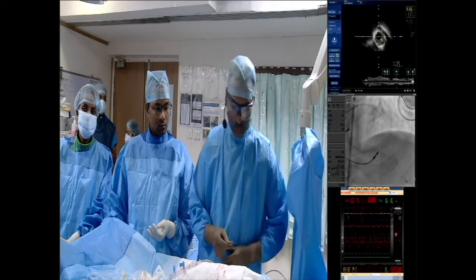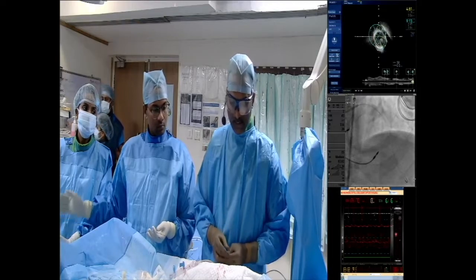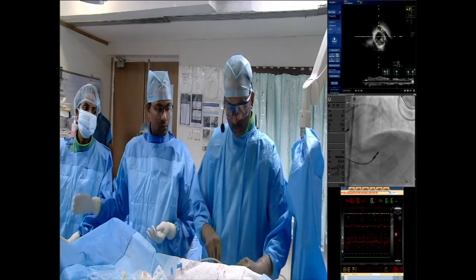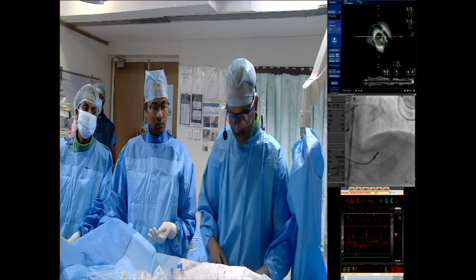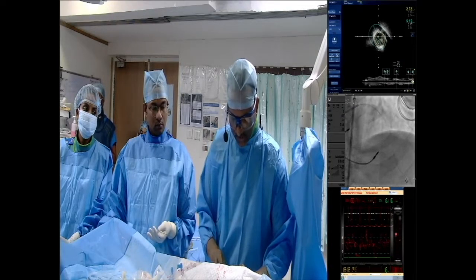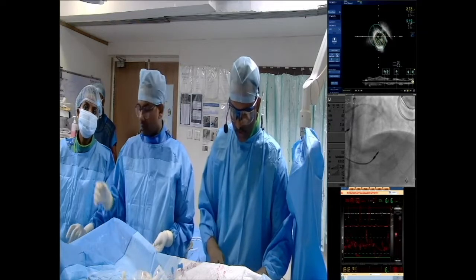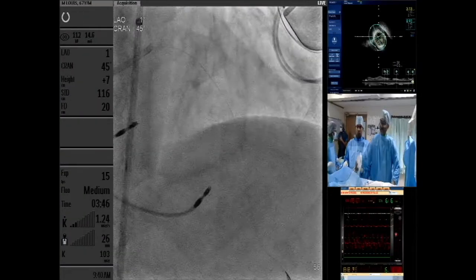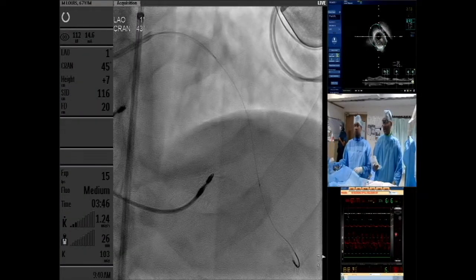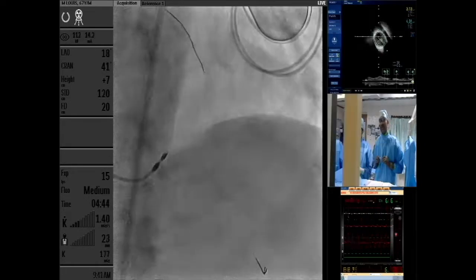So if you put a wire at the distal cap, pull further. That wire acts as a guide for my antegrade wire escalation. That is principally the reason why I want to put a retrograde wire first and then start antegrade wiring. We have also marked the location of the septal. This is the location of the septal in IVUS.